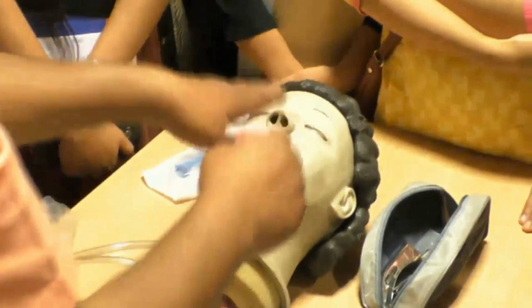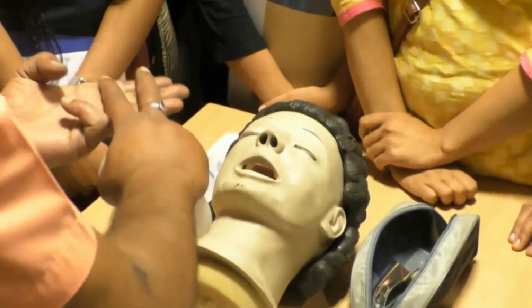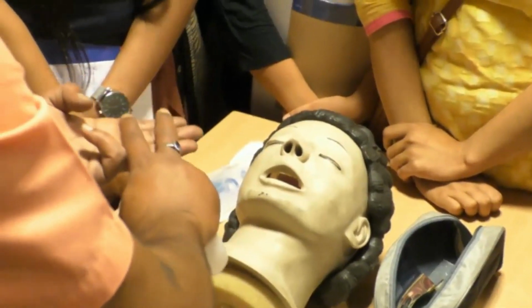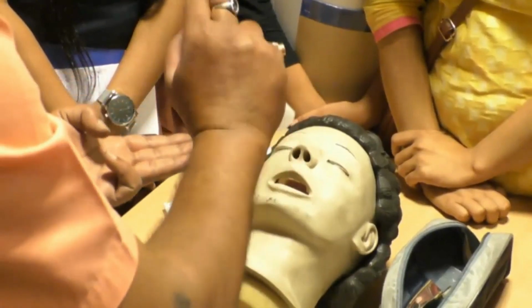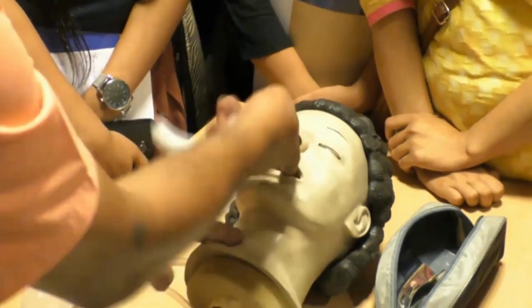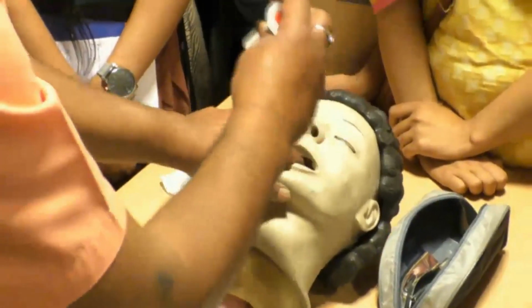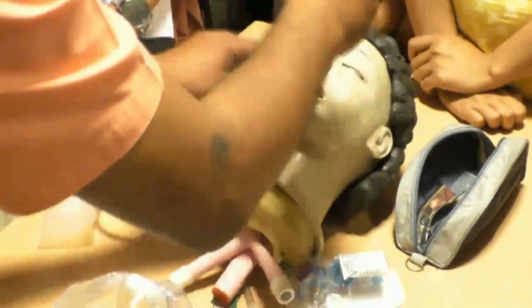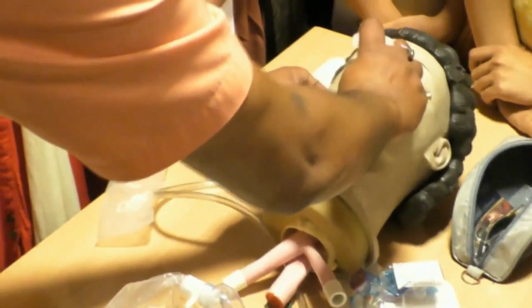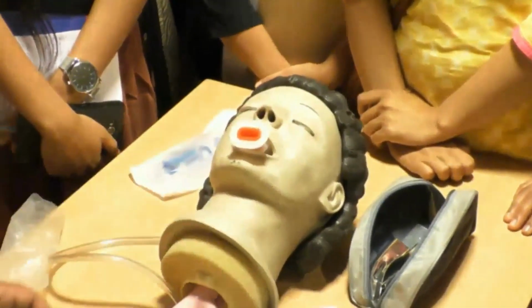Initially there is a hard palate. Up to some extent, there will be hard palate. ठीक है? We can't rotate it there. Once we go further posterior, there is a soft palate. ठीक है? In the area of the soft palate, we can rotate this. Why? To avoid trauma. So with the concavity facing upward towards the hard palate, we insert it up to the soft palate, then rotate it 180 degrees, and then press it further in.